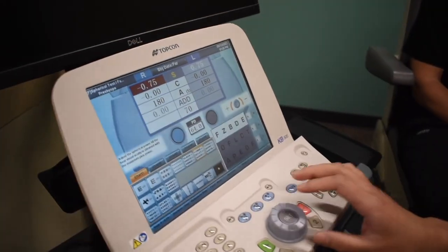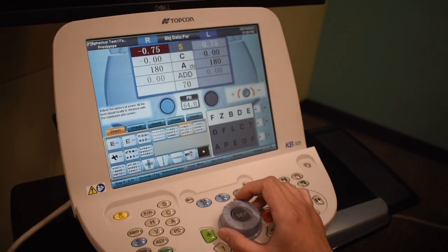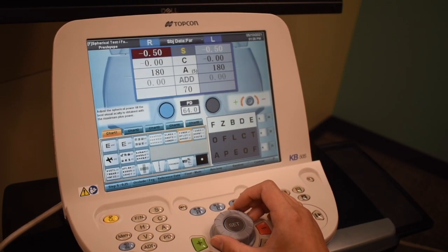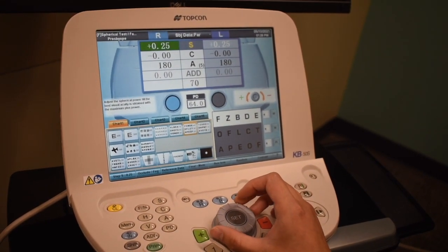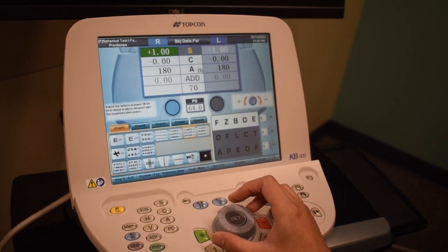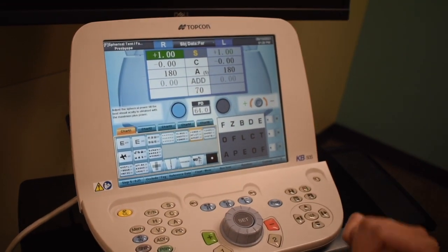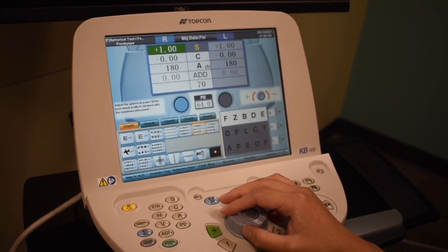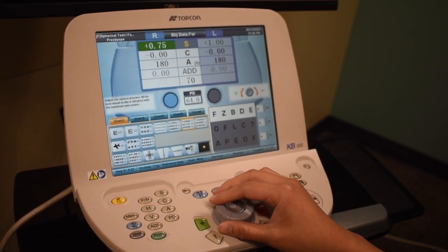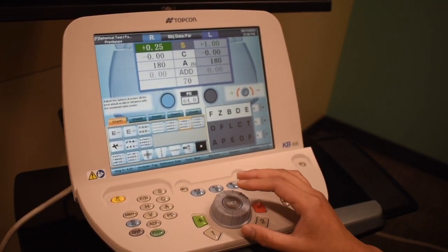Dr. Heffer, can you see the line out there? I'm going to go ahead and add some lenses in front of your eyes. Tell me when you cannot make out any of those letters. Then I'm going to click here, so we're just isolating his right eye. I'm going to go ahead and add more lenses — tell me when you can just make out one or two of those letters. Two letters there — F and Z.